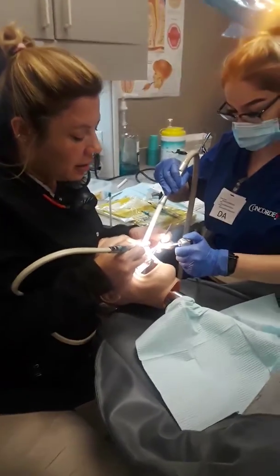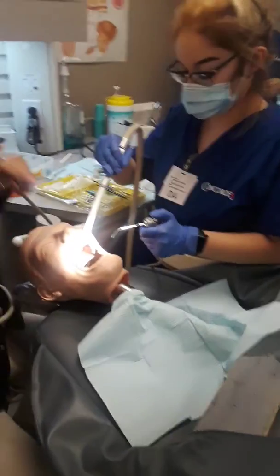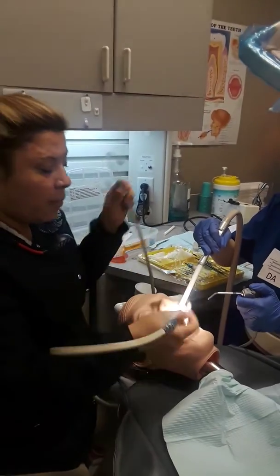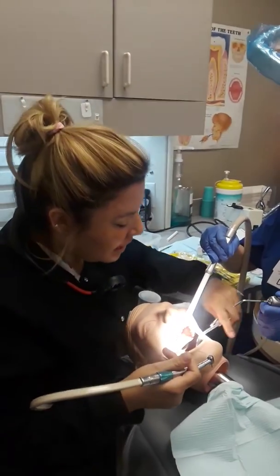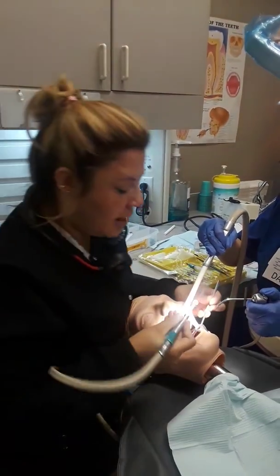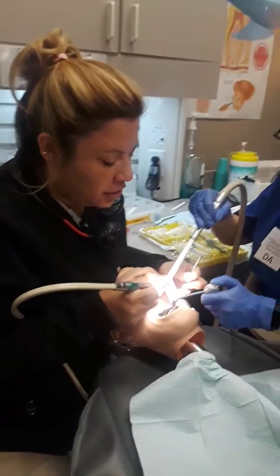Since my water is pointing down, we're going to hang the suction to the back of the throat so the patient doesn't drown.